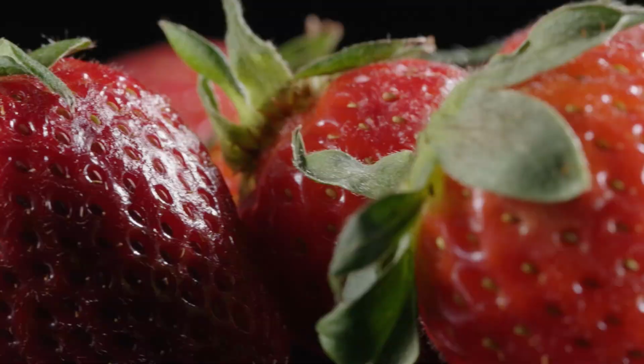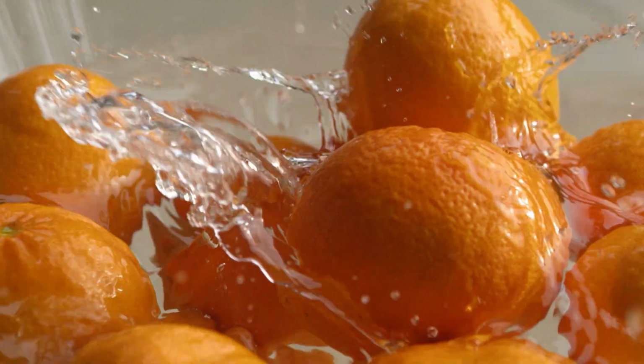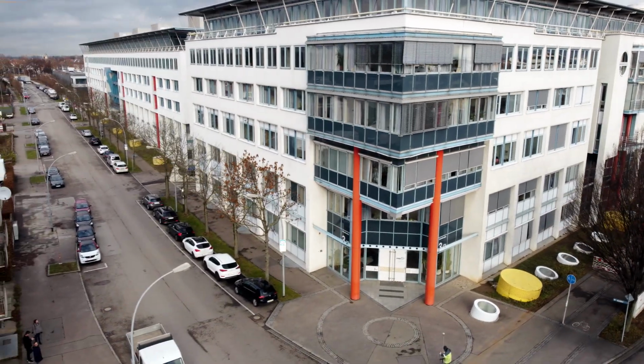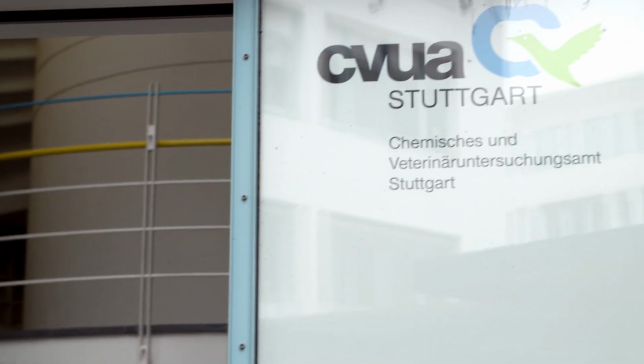In agriculture, the right timing and the amount of pesticides used is crucial. Standardized analytical methods allow labs like the CVUA in Stuttgart to control pesticide levels in food.